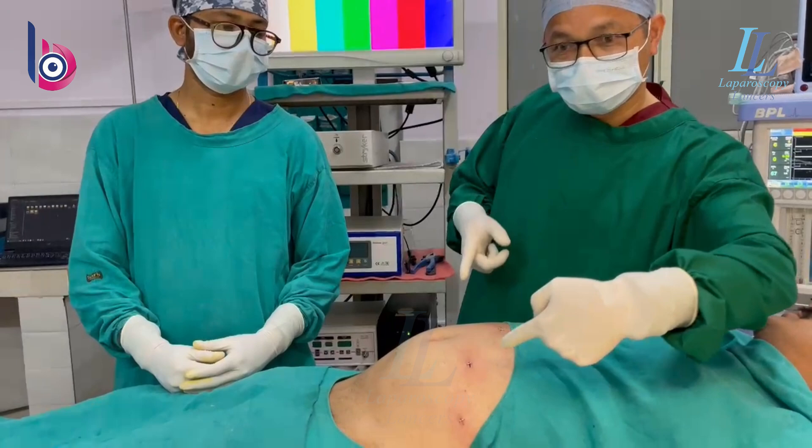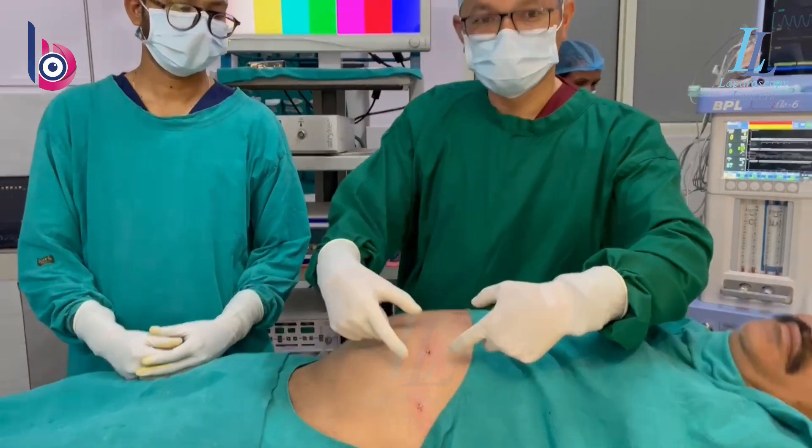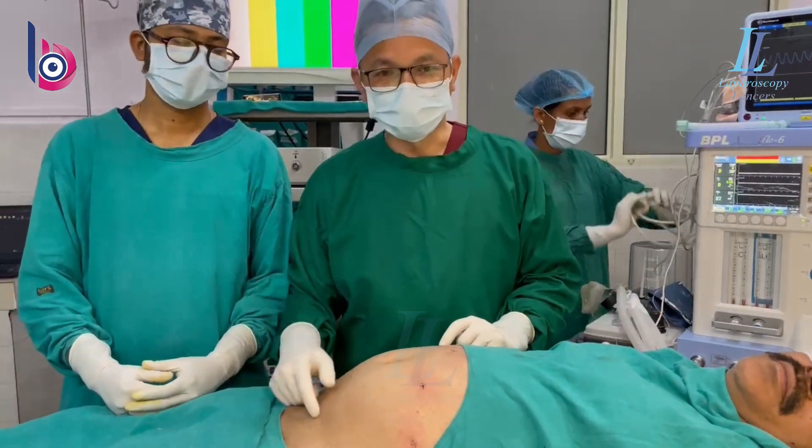Otherwise, you have to work and your shoulders get tired. In this case, the shoulders will not get tired. So let's see the surgery.